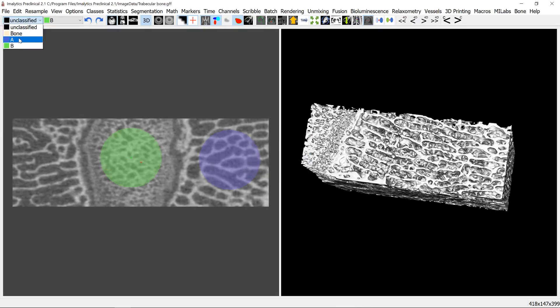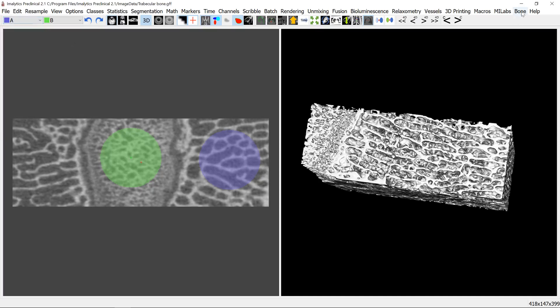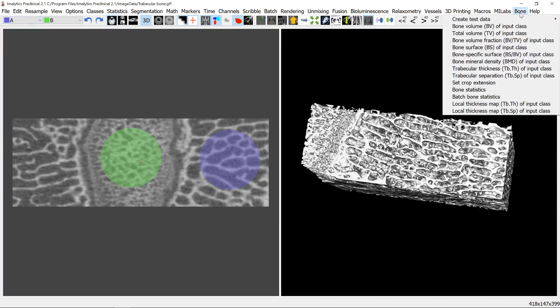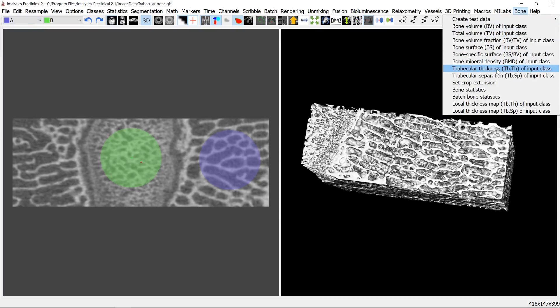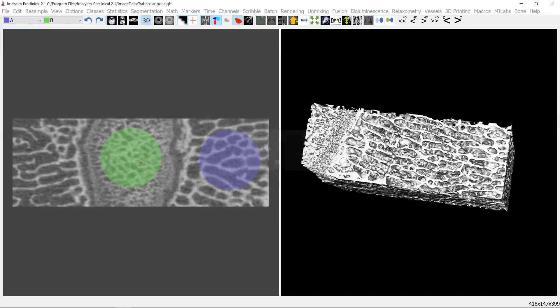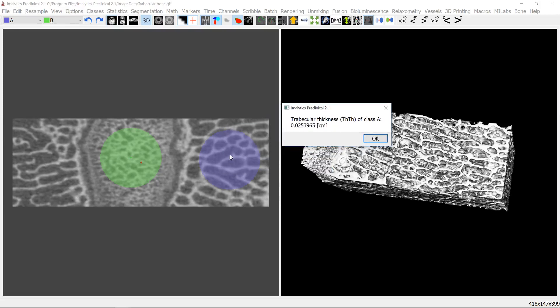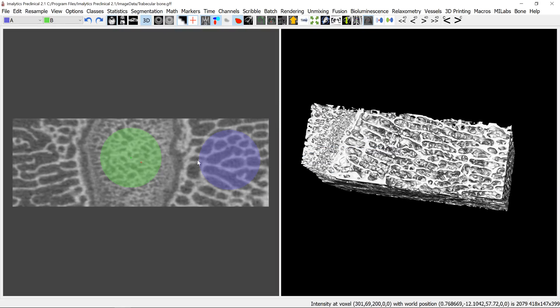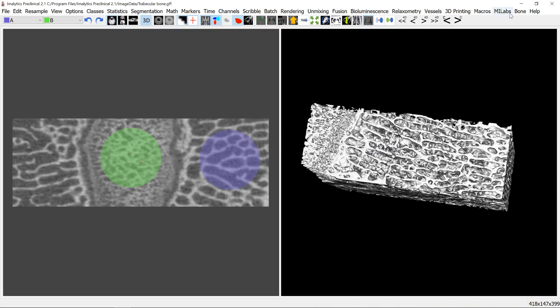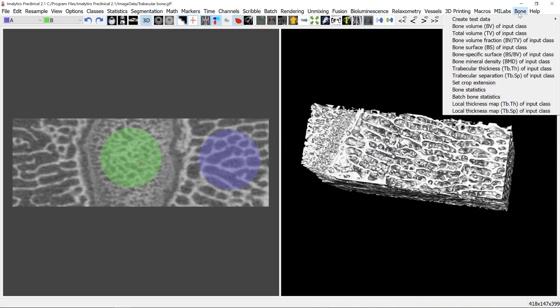So now we can select one of them as input, class A for example, and then the bone module here we can tell it to compute the trabecular thickness. We have to enter the threshold that we used and the trabecular thickness of class A is 0.025 centimeters. And we can do that for B as well or we can compute the trabecular separation here, also called spacing.